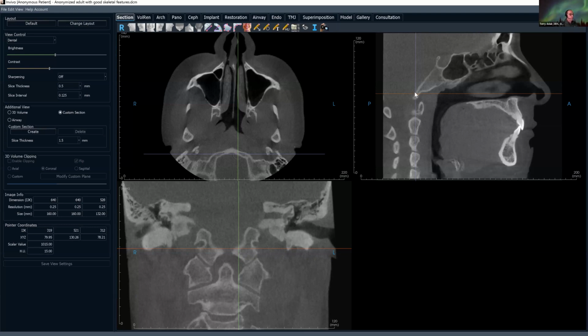At the same time, we're scrolling through, we're going to see the malleus. This is one of the inner ear bones. Cochlea is going to show up in just a moment. And we also see the external auditory canals to see if there's cerumen. Apparently, we have to look for earwax. Which is not insignificant because I've had a couple of cases where the report is patient claims stuffiness or hardness of hearing or something, and lo and behold, it's full of earwax. So I guess that can happen. It's pretty obvious when you see it. So this canal would be full of some foreign object.